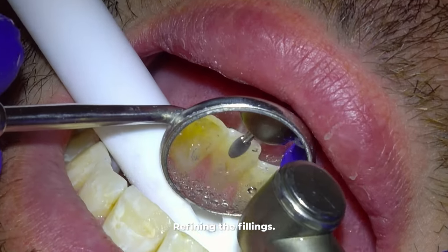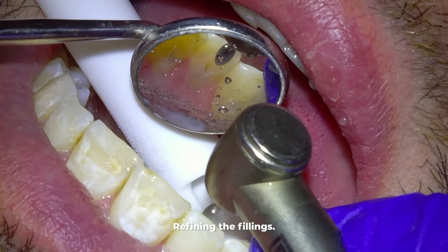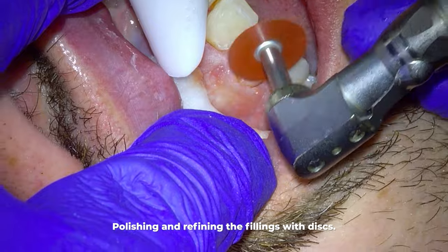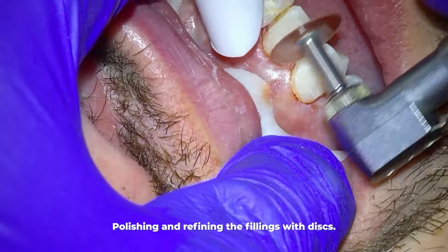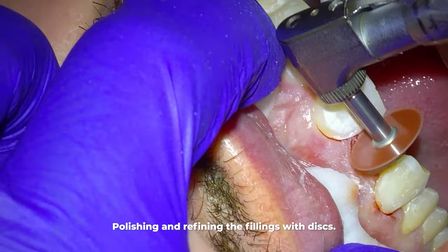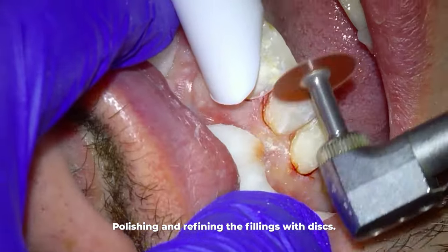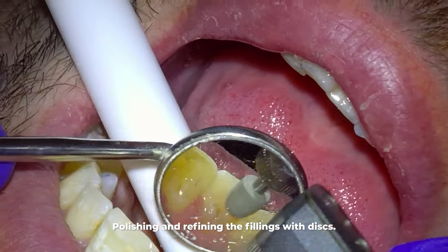More importantly than the staining itself, decay can also get in there. The smoother these fillings are and the more seamless the transition, the better. Here I'm using my little explorer to see if it catches anywhere, and it does catch in a few spots where I need to smooth it out more. This little excess you can catch on your explorer is called flash — it's hard to see but still needs to be removed. If there's enough there to catch my explorer, there's enough there to catch stains and possibly tooth decay. Luckily if the dentist misses this flash and it gets stained years down the road, you just quickly redo this step and the stain goes away with it.